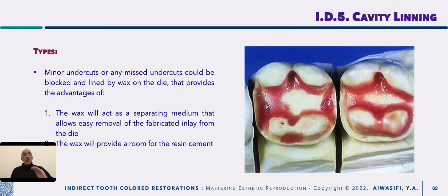When you construct your material, especially composite resin inlays, over a wax, then its fitting surface, number one, will not have sufficient free radicals, because you are already consuming them by complete polymerization with a high degree of conversion, as we discussed before. At the same time, your fitting surface is covered by an adhesive film, which is the wax, that prevents proper adhesion.